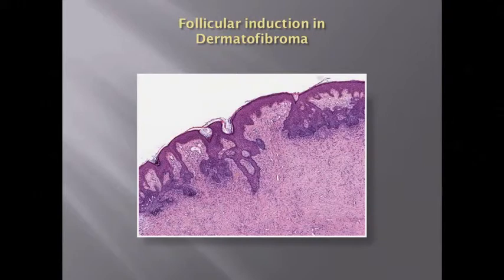Dermatofibromas, again, as we know, have so many varieties which have been described, but the classical one has these short, spindly cells. But usually, you have the granular variant, the pigmented variant, the spindle cell variant, some of them even looking like leiomyomas. So only when you do the immunohistochemical markers to differentiate do you realize that they are dermatofibromas.